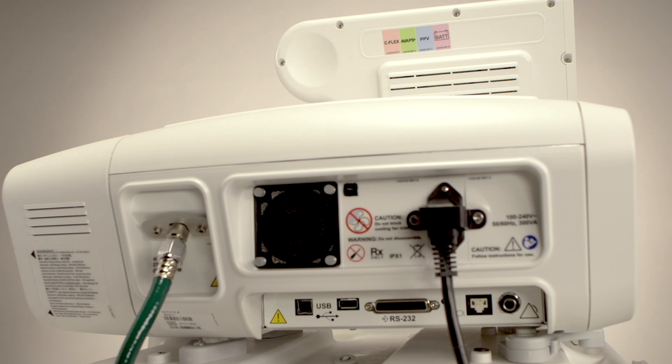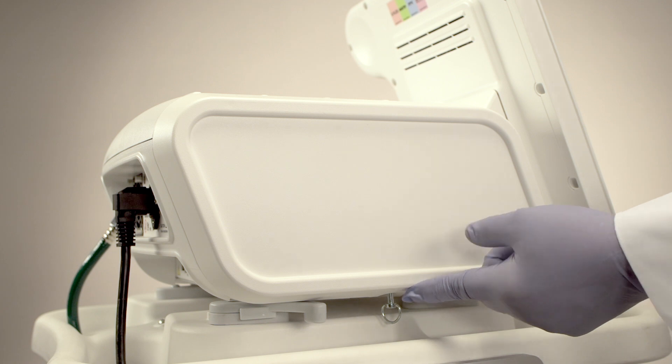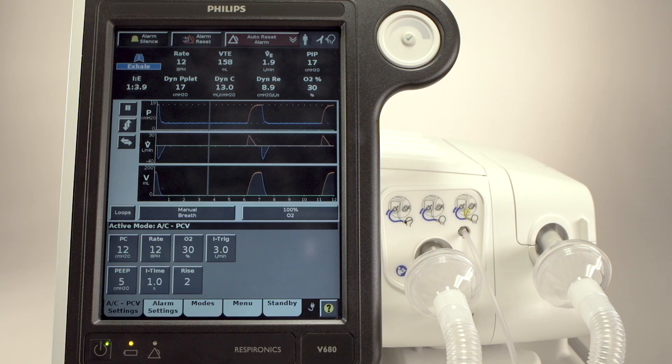Rotate the unit another 90 degrees. There is a turnkey below the side panel that releases it for easy access to the 4-hour backup battery. Turn the unit another 90 degrees, and the GUI will be facing you once again.